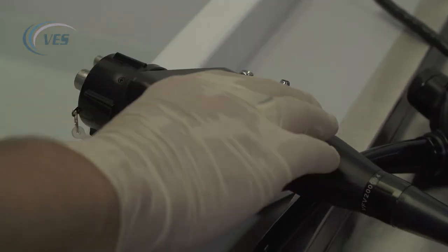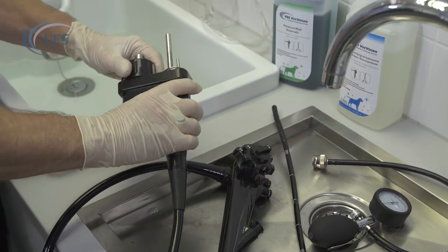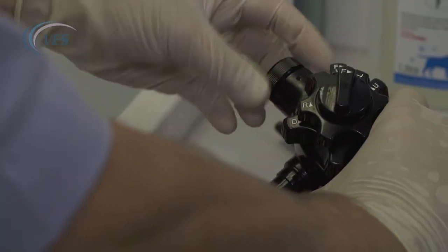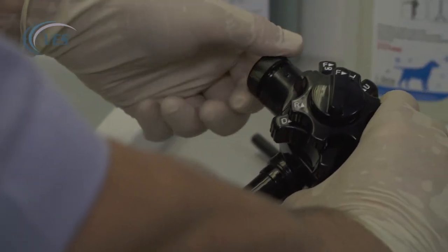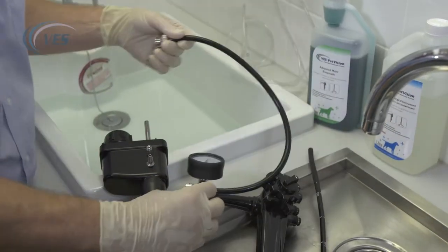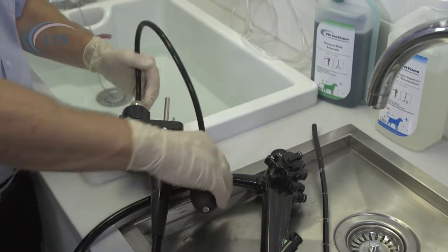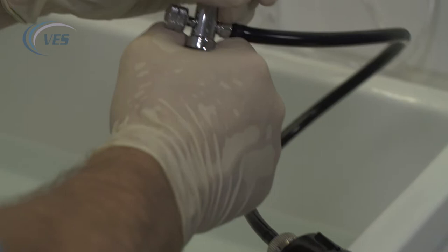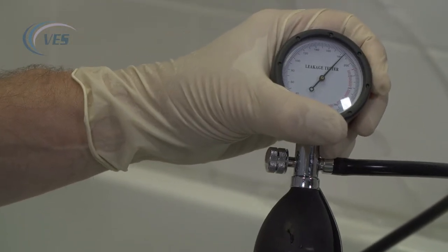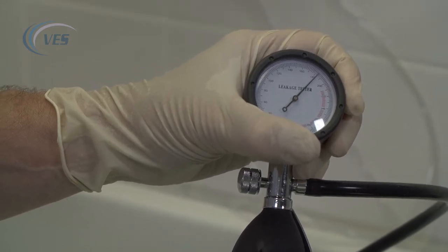For the video scope, it's very important that you make sure that the two waterproof caps are in place prior to any cleaning of the scope, so it is very important that these are actually in situ. What we're going to do next is to attach the leak tester and inflate to approximately 180 millimetres of mercury, making sure that we are airtight prior to immersing the scope into the enzymatic cleaner.